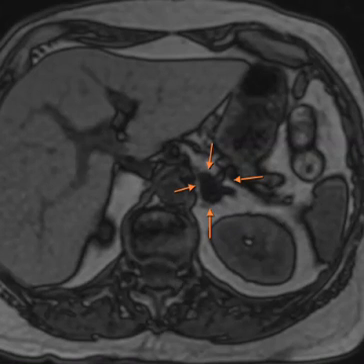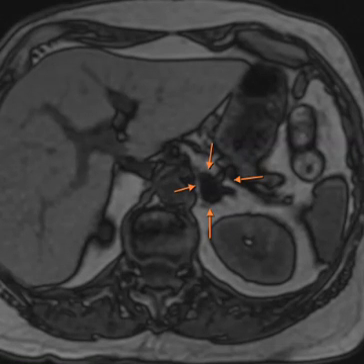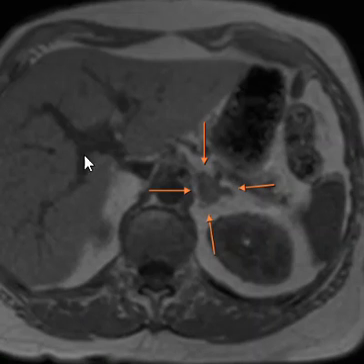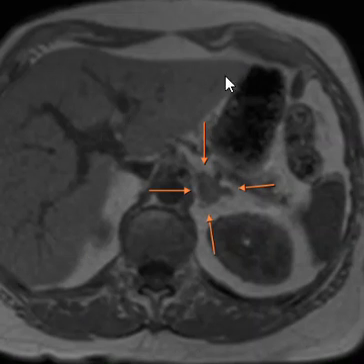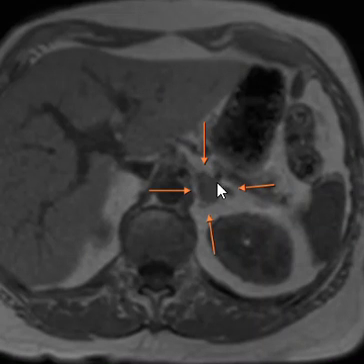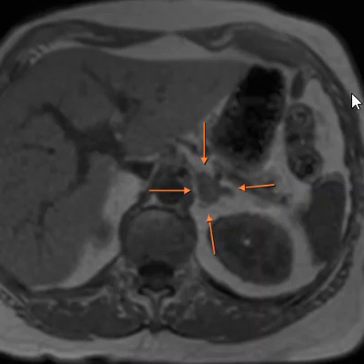This is a classic case of a benign adrenal adenoma with signal dropout on the out-of-phase images. Here again are the in-phase images — you can see there's no chemical shift artifact around the periphery, and it's very uniform and similar to the liver. Thank you very much.